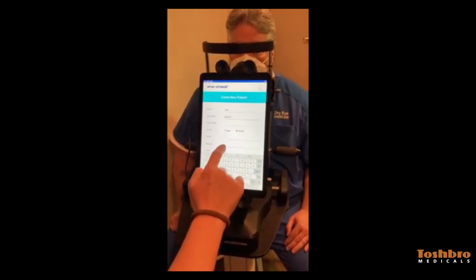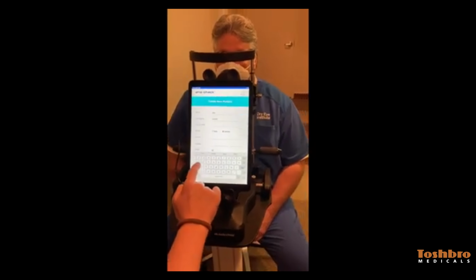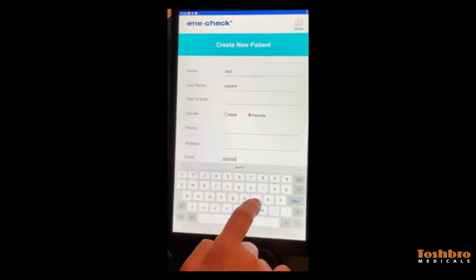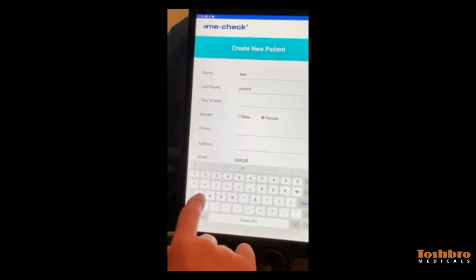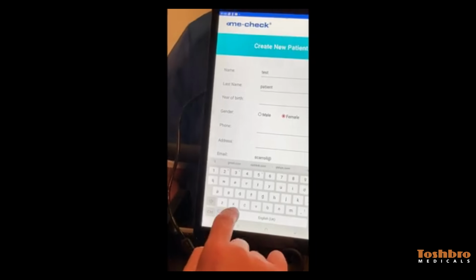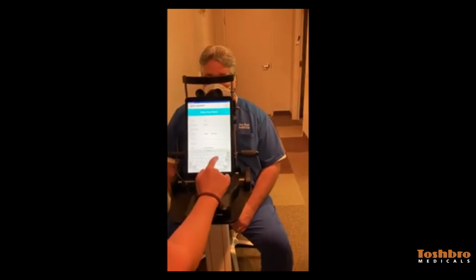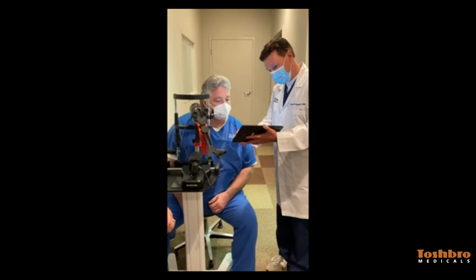But one of the things I really like is at this point, I could use that information for a number of things. One, it gives me a grading of the patient's symptoms and signs. Number 2, I could send that into my EHR, so we lock it in. And the third thing that's extremely exciting is that I can actually take this device, which is essentially a tablet. I'm able to bring up the images and use it as a teaching tool in instructing my patient. Because Michael, I think now I can show you your meibography images.